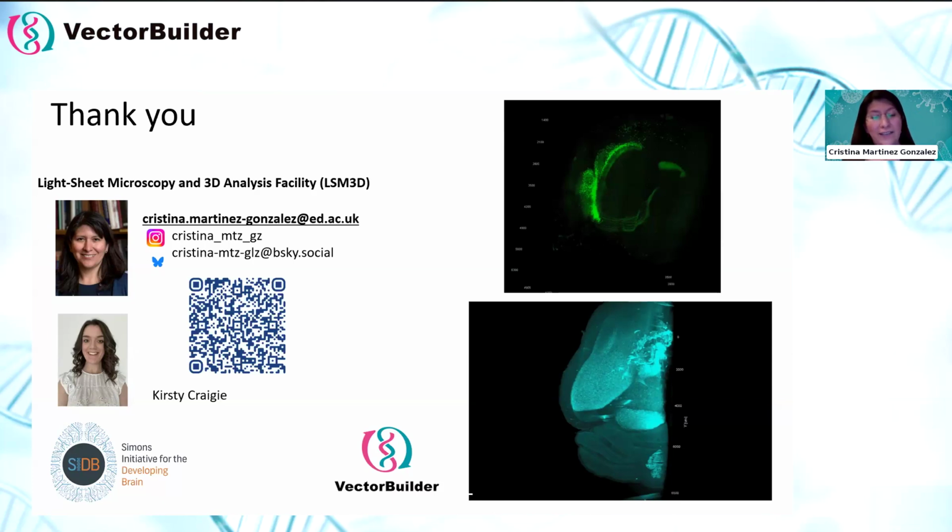And it's quite a precious tissue, so we have no chance for error. For human tissue, I would recommend solvent based because it would last forever, because it's a precious sample that you can image and re-image and re-image.